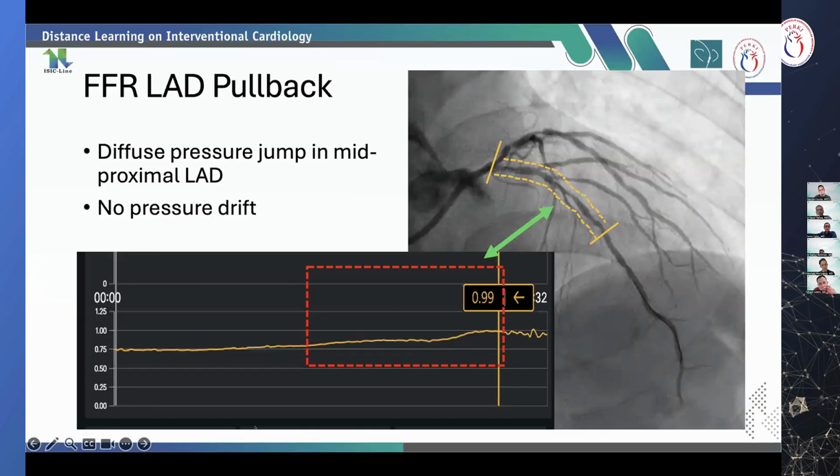It means there is a burden of ischemia. But the diagonal 2 has a very critical ostium. From the IVUS, I see a fibrocalcified moderate to mild lesion, and maybe intervention.